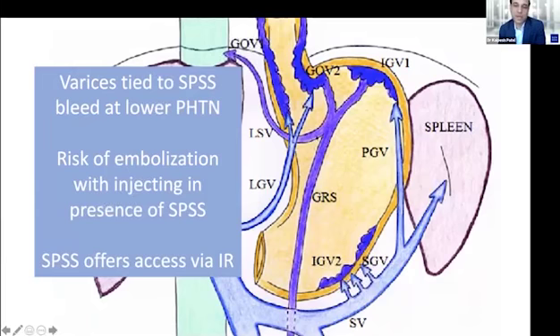You can see a systemic shunt going to the renal vein. These can bleed at a lower rate or lower portal pressure because of this dual supply. So sometimes we can overlook these if we're relying on traditional measures like portal pressure measurements, or we may be surprised, why did this patient bleed when we didn't suspect such an advanced source of liver disease.